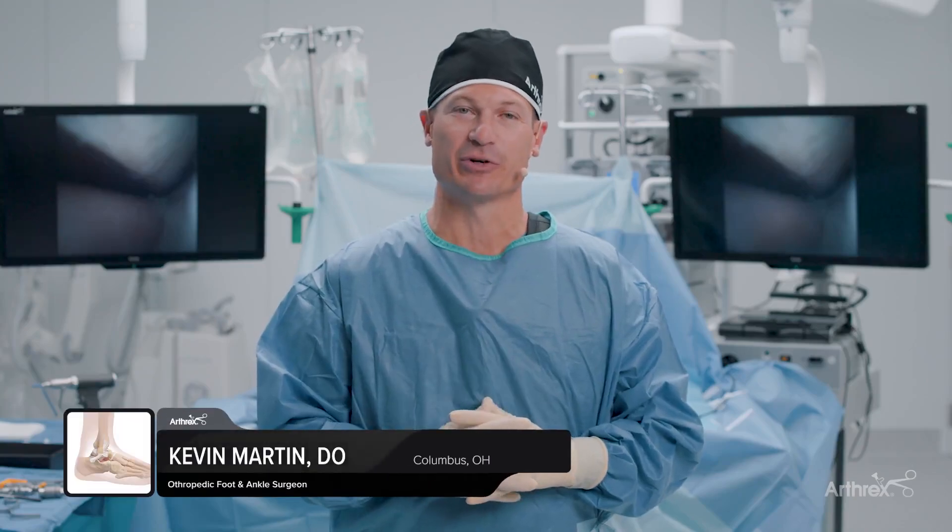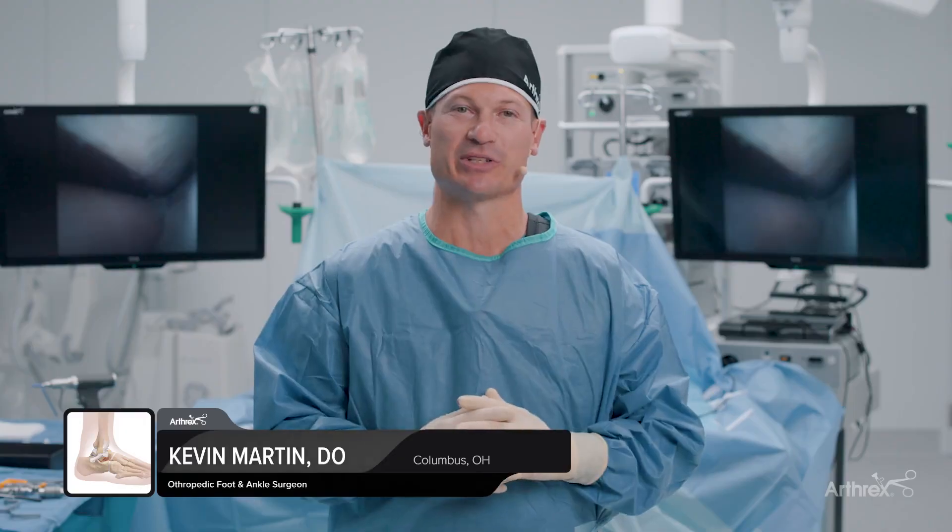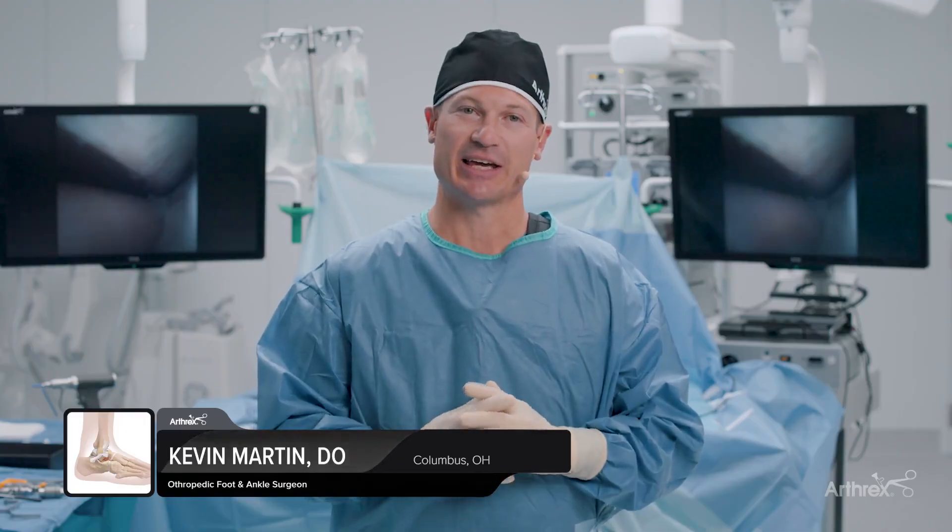Hi, my name is Dr. Kevin Martin. I'm an orthopedic foot and ankle surgeon from The Ohio State University. In dealing with high ankle sprains in athletes, we first begin by looking at the high ankle sprain with a nano. We identify the torn ligaments and the instability. After that, we reduce it anatomically and start with our XP stabilization with a tight rope. We then work distally and augment with the internal brace across the front of the AITFL, giving us two points of fixation and getting our athletes back on the field sooner.